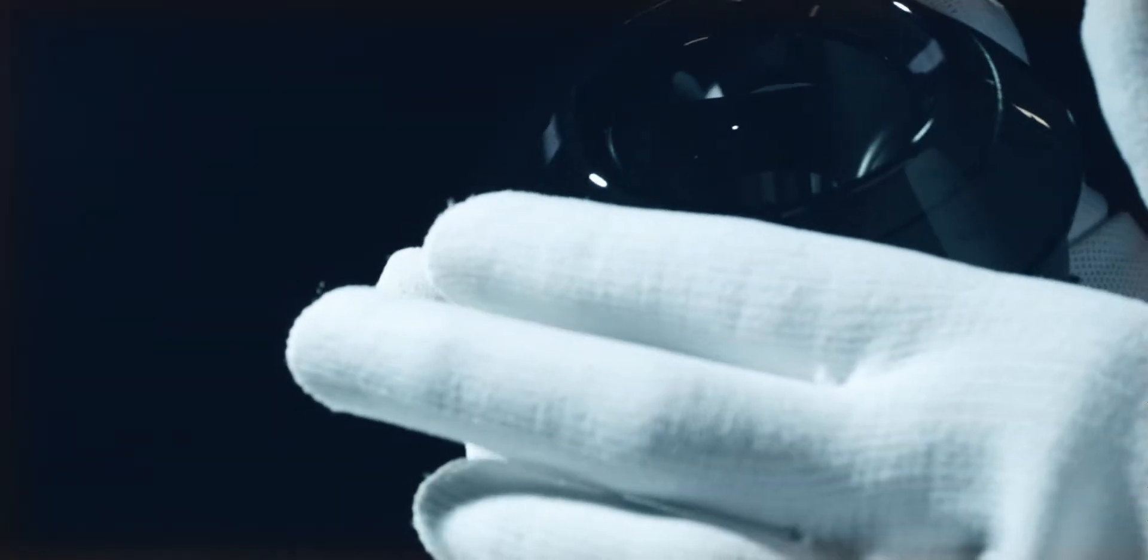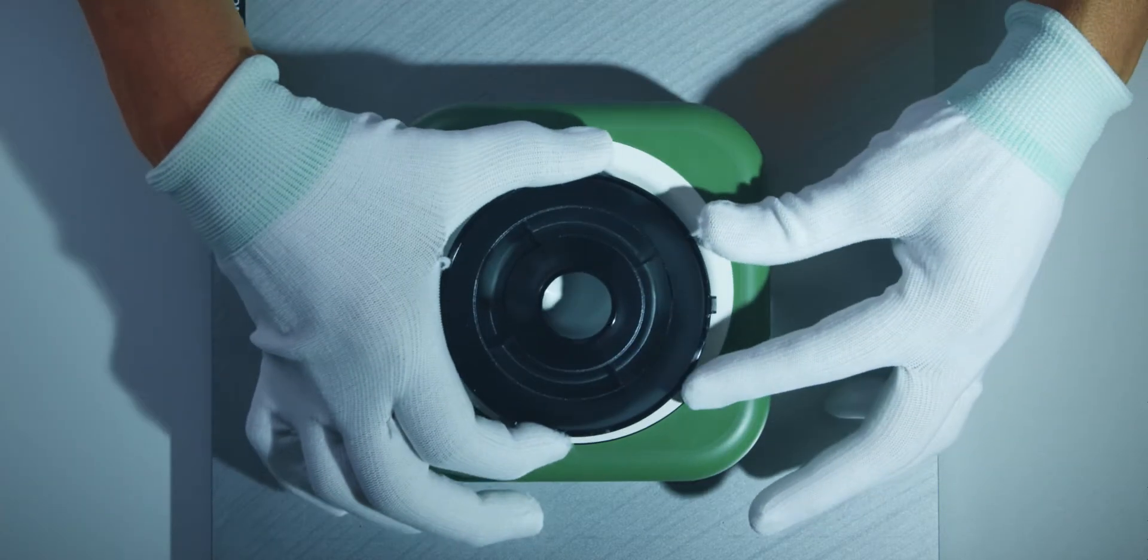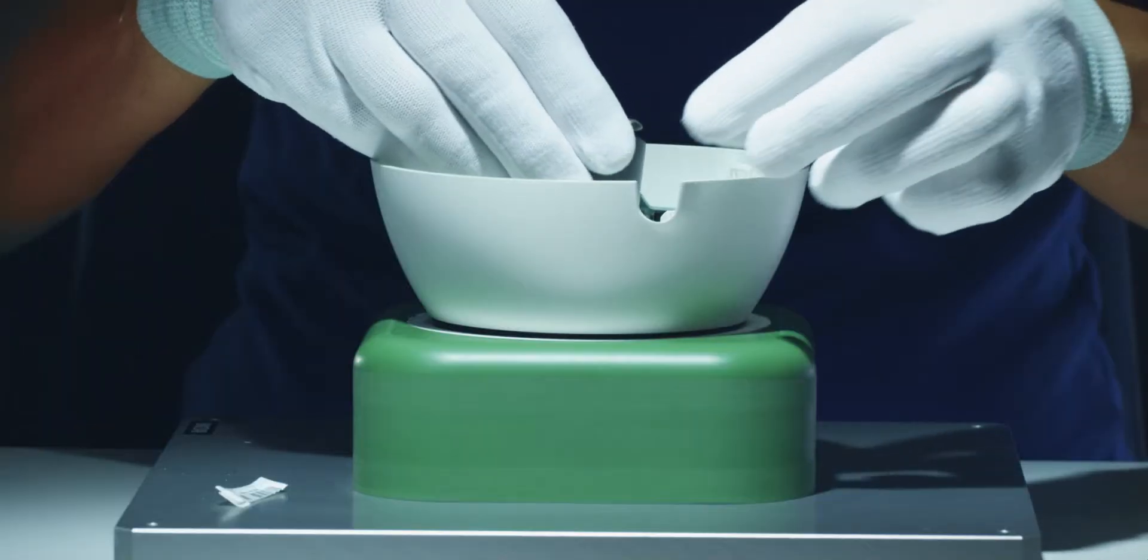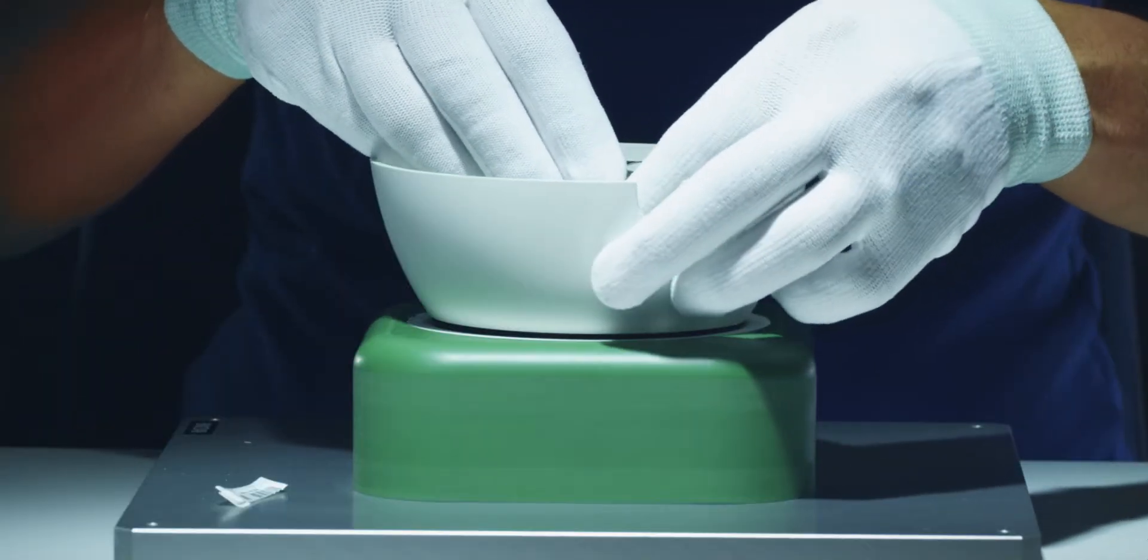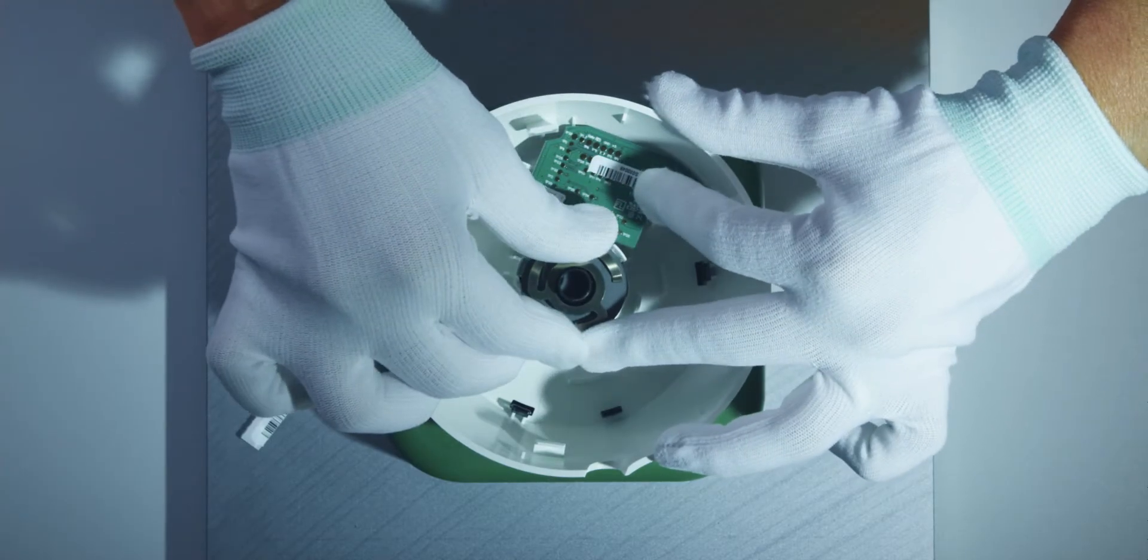Blue phase means a manual production process by well-versed specialists and perfection down to the last detail.